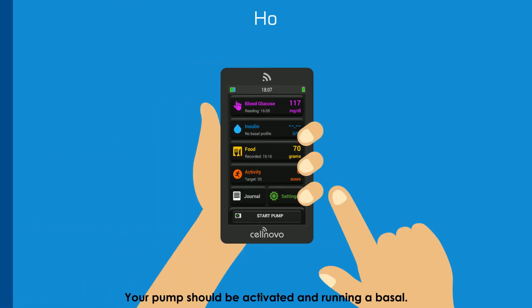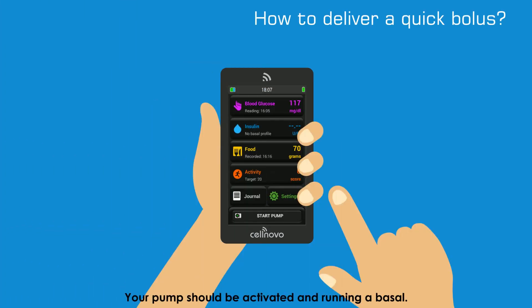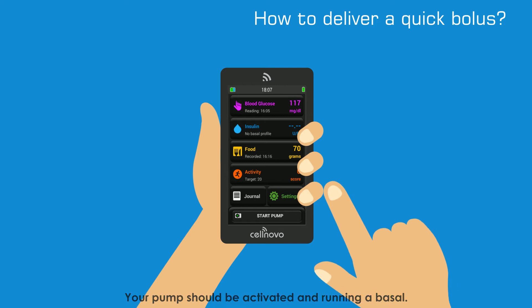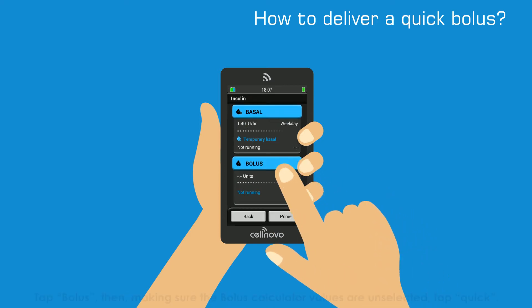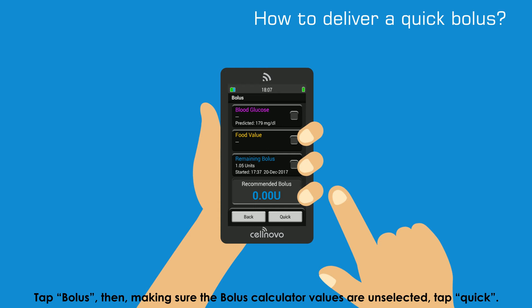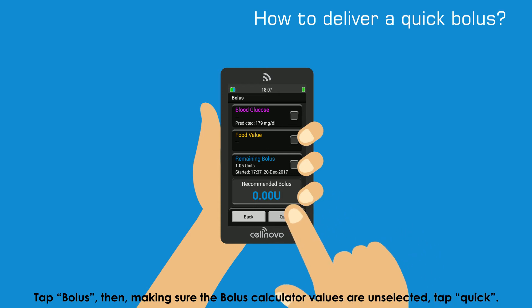Your pump should be activated and running a Basal. Go to the Insulin app. Tap Bolus and then, making sure the Bolus calculator values are unselected, tap Quick.